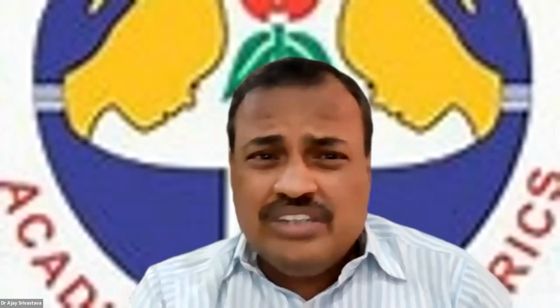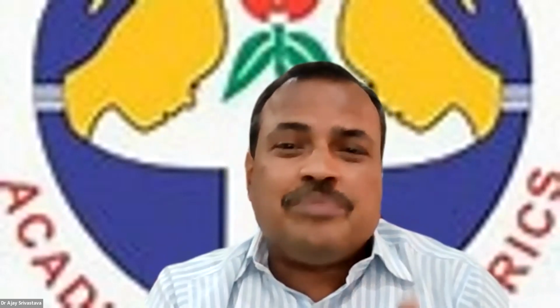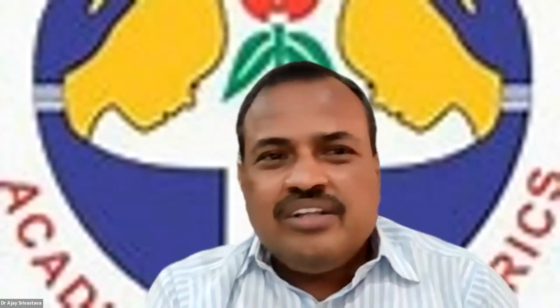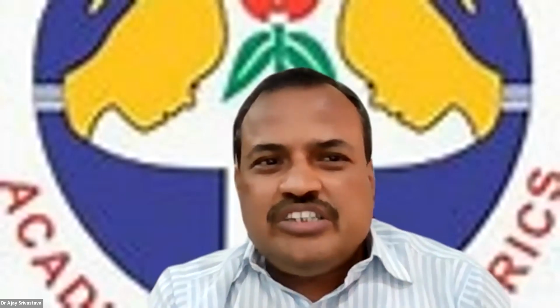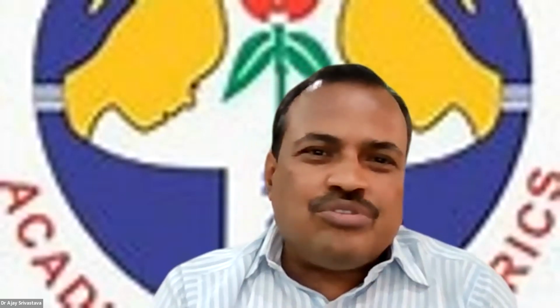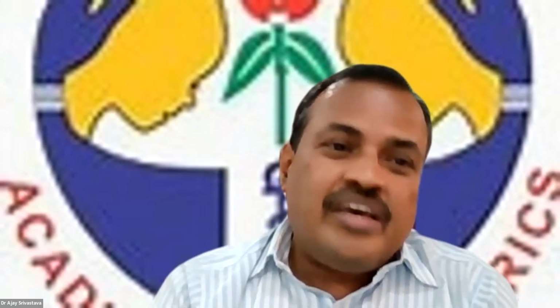So what is, our first lecture, that was indications of EEG in childhood epilepsy. If you keep in mind these 6 things only, then you can make better use of EEG. Like it supports diagnosis of epilepsy when clinical history is suggestive.